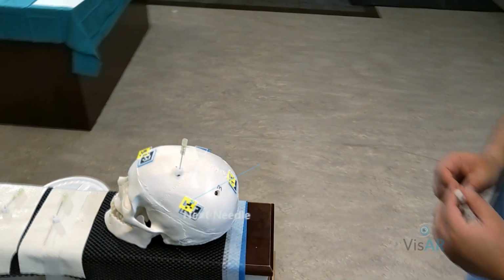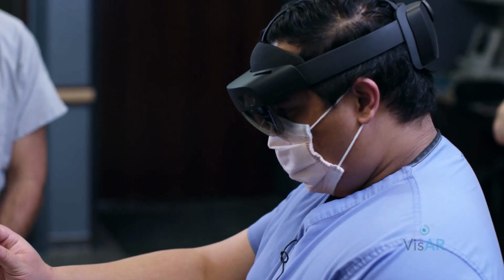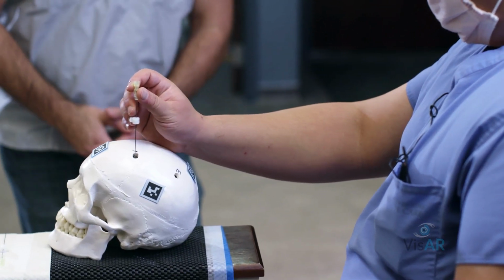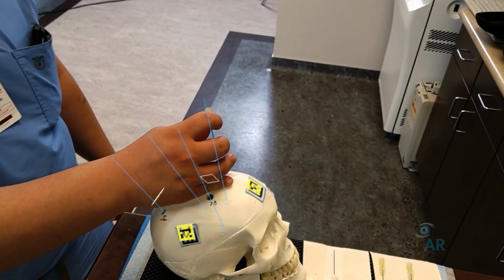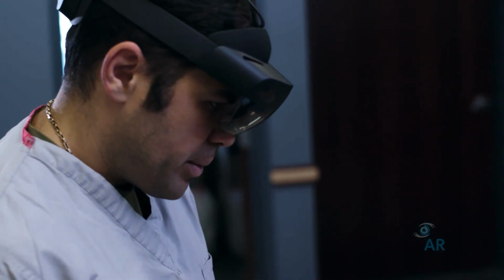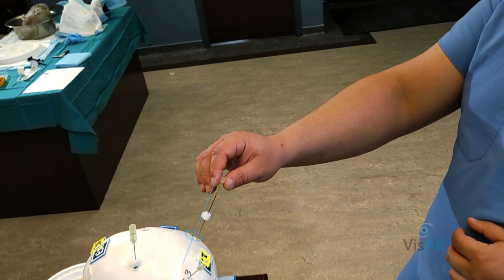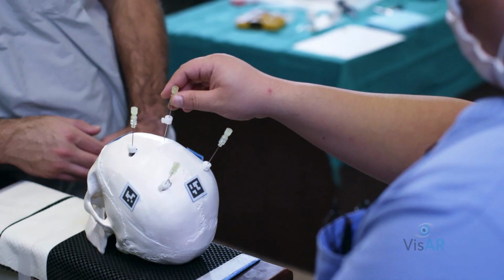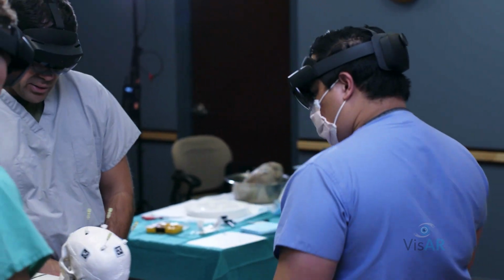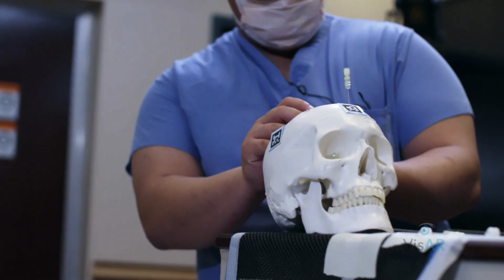Next needle. So that's lined up from my view. That's lined up there, so you want to kind of tilt your hand back more, keep going. And that looks pretty good from this angle. Okay. Picking a second angle here. Move your trajectory, your entry point a little bit more lateral, just a couple millimeters, just a little bit more. That's pretty good, man. Yeah, it looks great. All right. Feels pretty good.